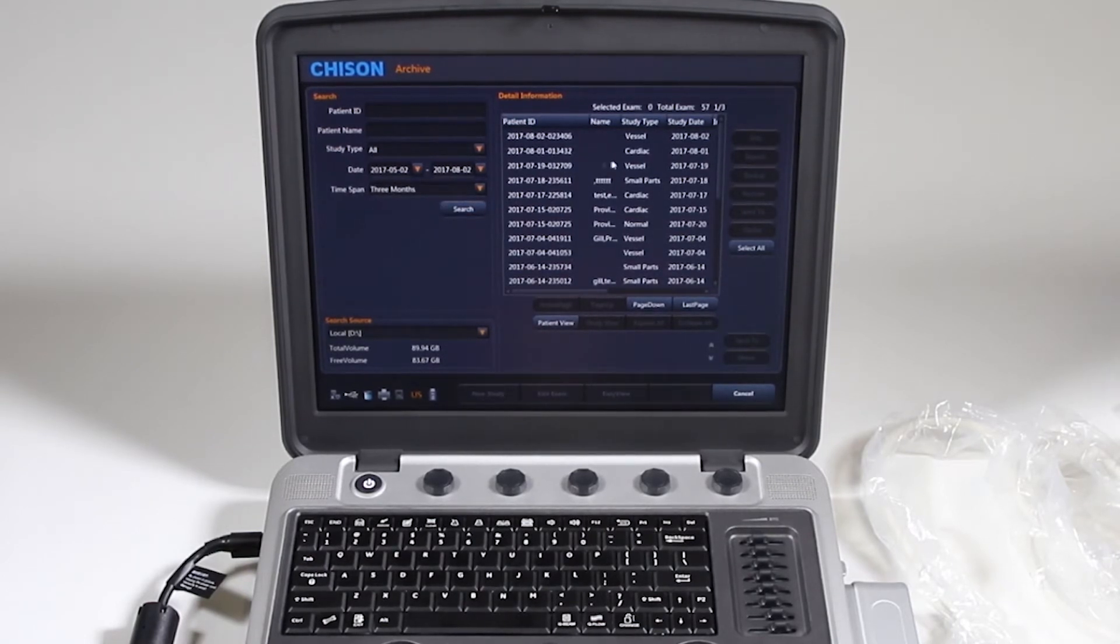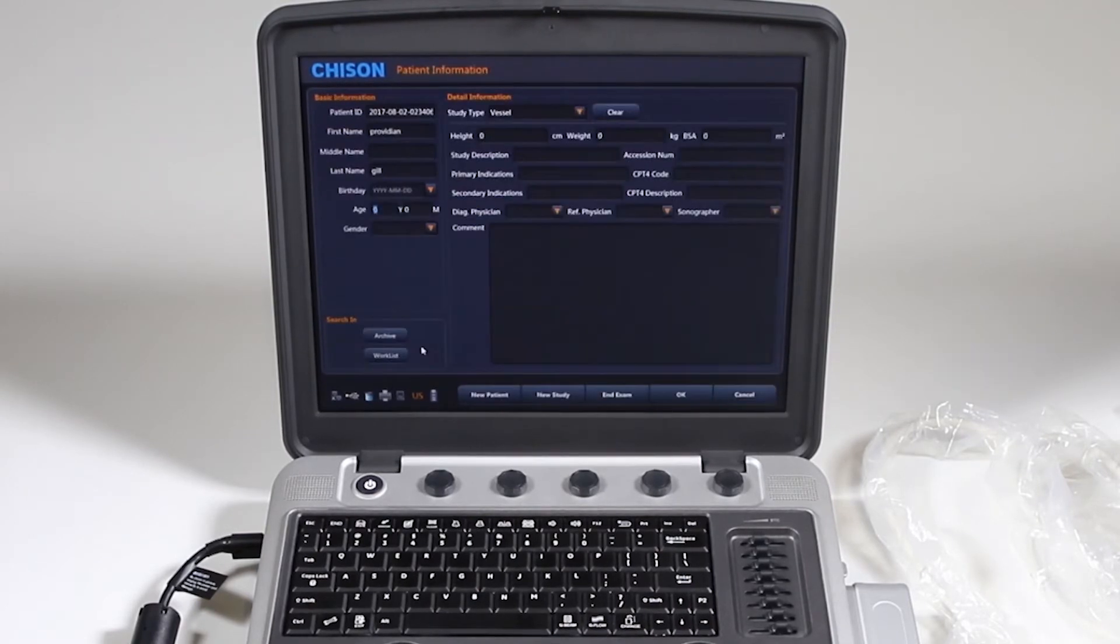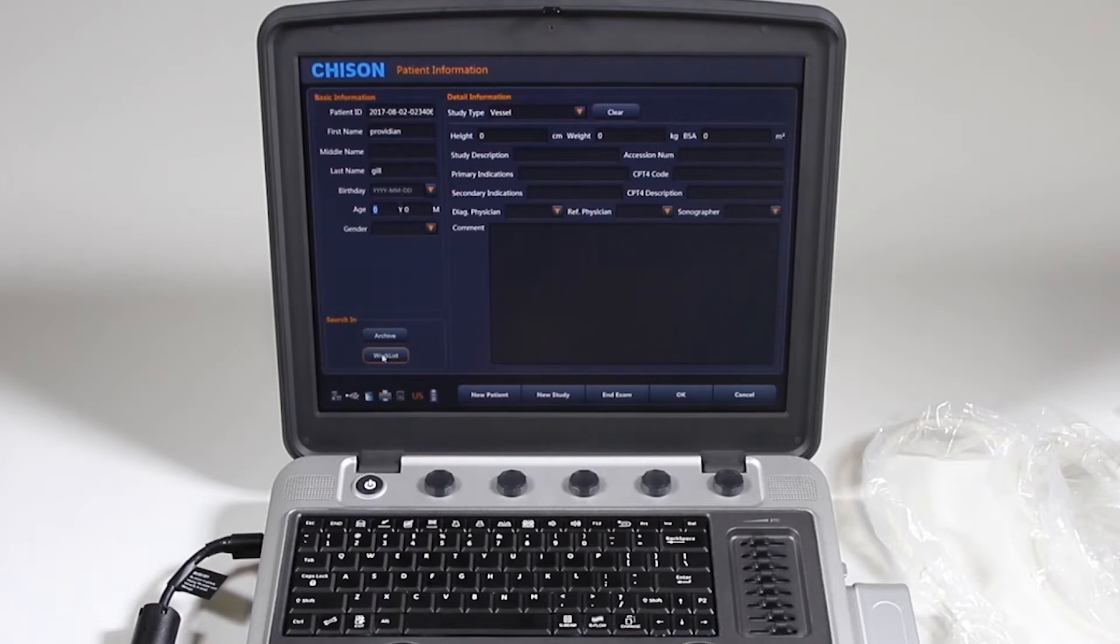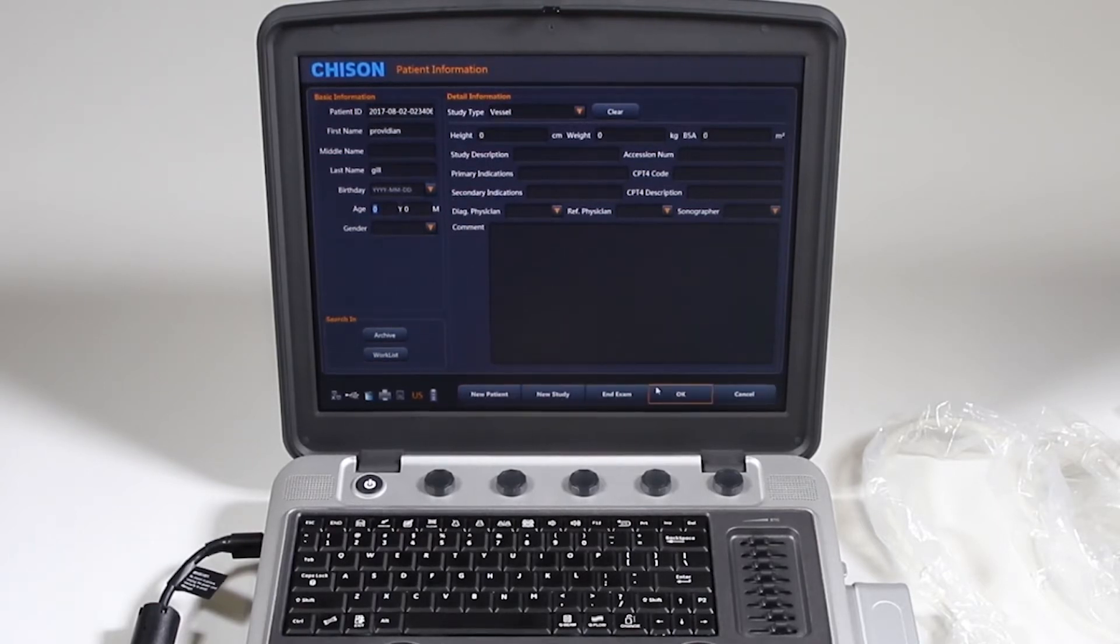Then you have your ID, your name, study type, etc. But we're not going to do that right now. Okay, so you can also choose the work list here. Down along the bottom, it'll say new patient, new study, end exam, okay, and canceled.